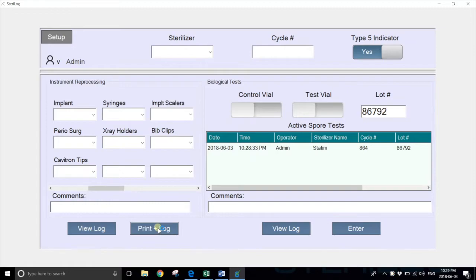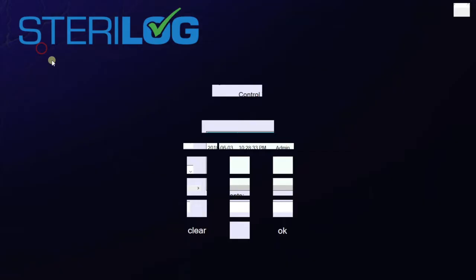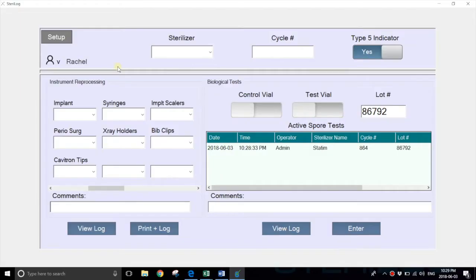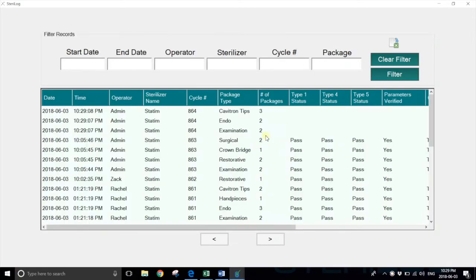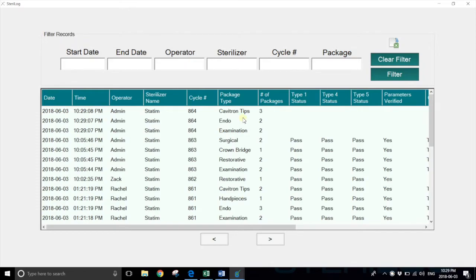About an hour later, once the cycle is finished, maybe a different user comes back to the system. For example, Rachel would hit view log and identify cycle 864 in the Statim. Here you have all your packages that have gone through the cycle.